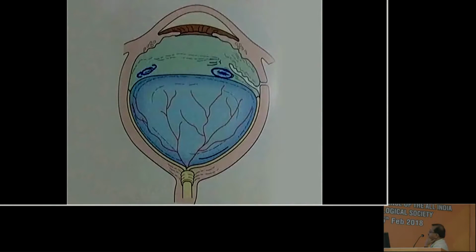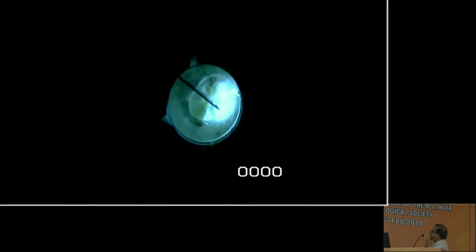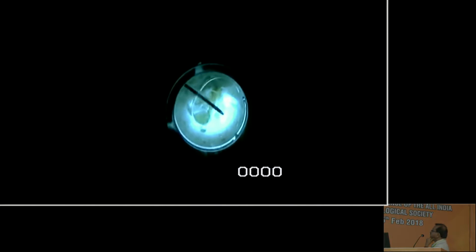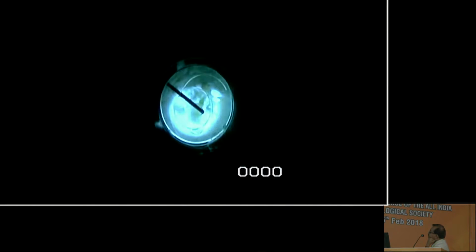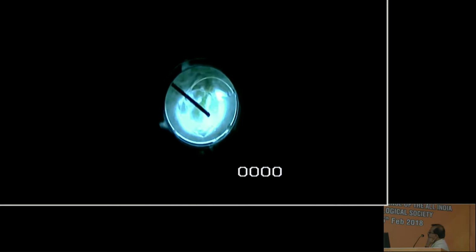The anterior face of the perfluorocarbon liquid tends to assume a convex configuration because of its density and surface tension. The same may also be tried to float up damaged IOLs with cut haptics or even sample IOLs. This gives a dry run of managing dropped nuclei or IOL.